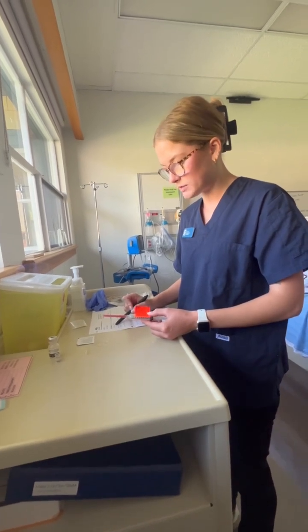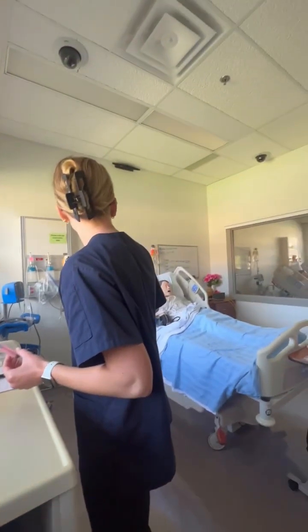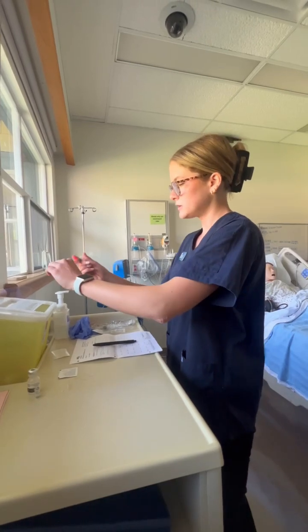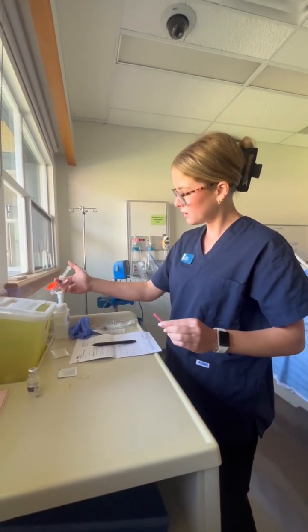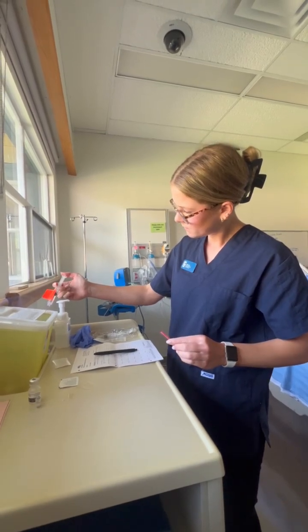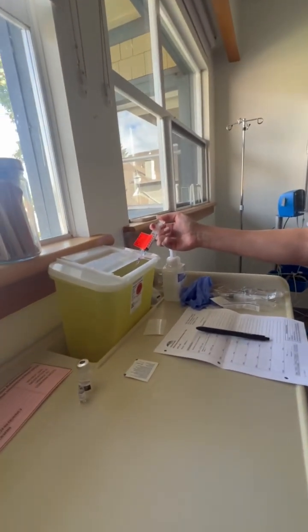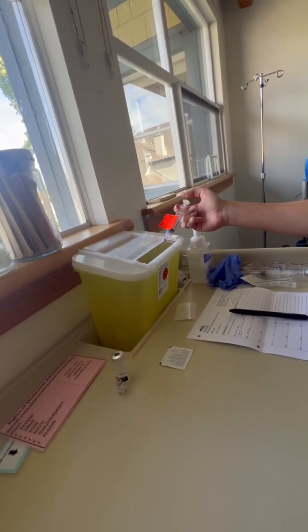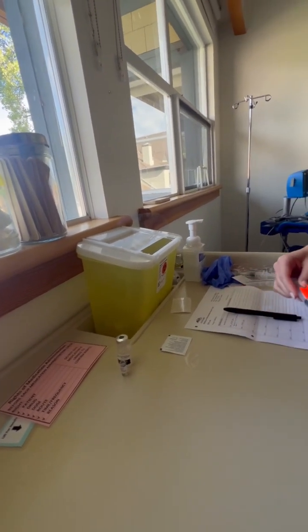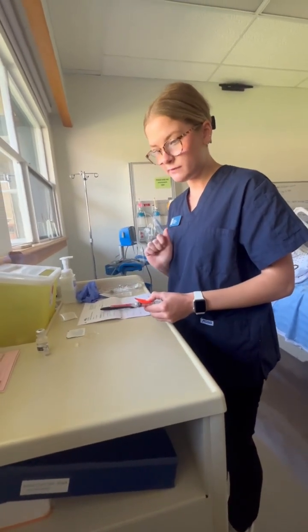At this point, I am going to make sure that I have the correct amount. So, I know from my math that I want to waste 8 milliliters of the medication. So I'm going to do that here. Ensuring I have 2 milliliters of the solution left. I am just going to scoop that medication there. Perfect. So I have the right dosage for the patient.